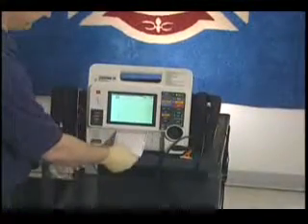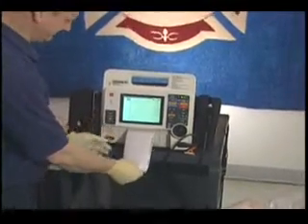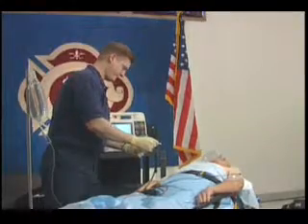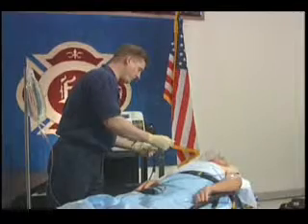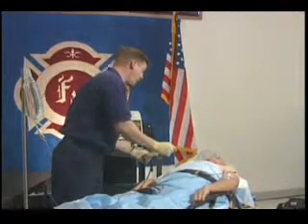Based upon the patient's condition and local protocol, assess the need to pace. Pacing is often used when the heart rate is too slow to adequately circulate blood. Sir, it looks like your heart's beating a little slower than we'd like to see. We're going to have to do some interventions to help speed your heart rate up.